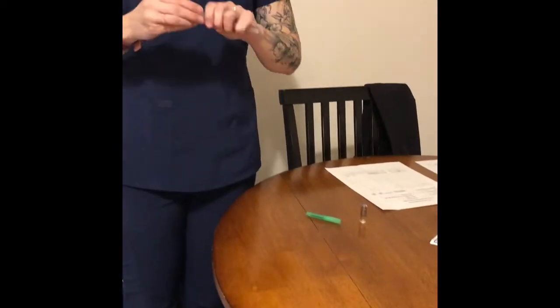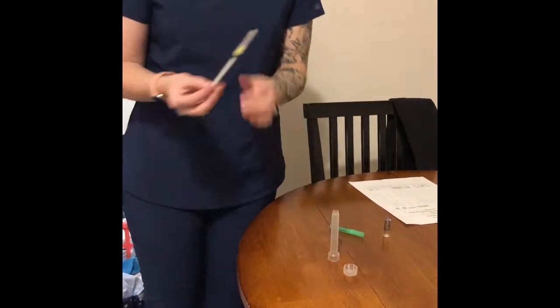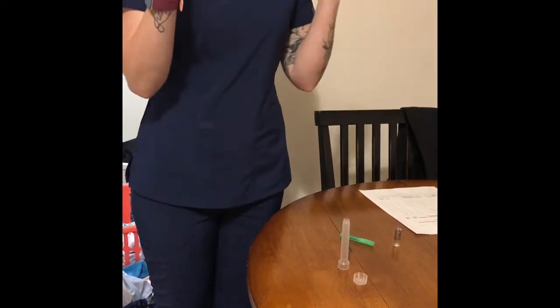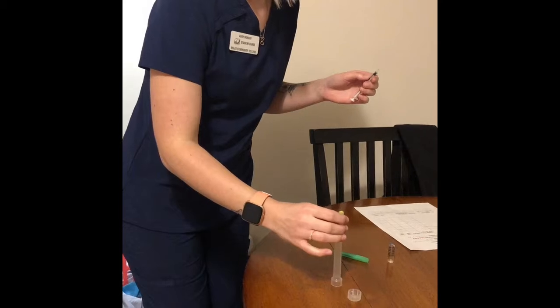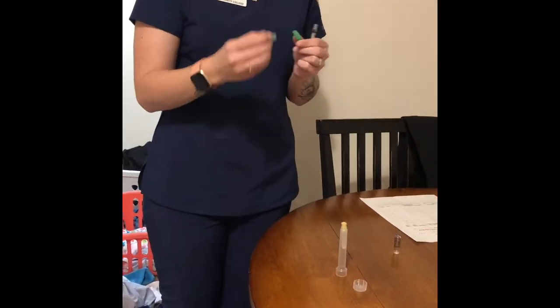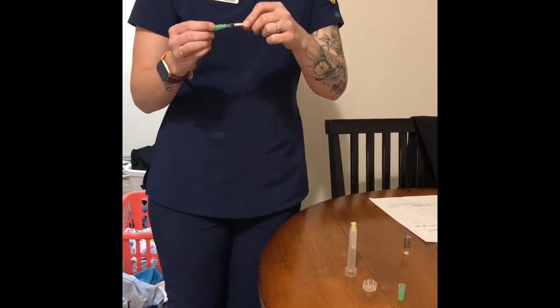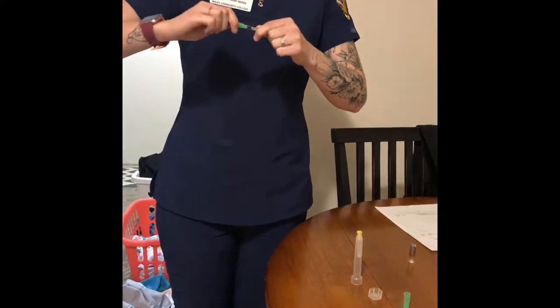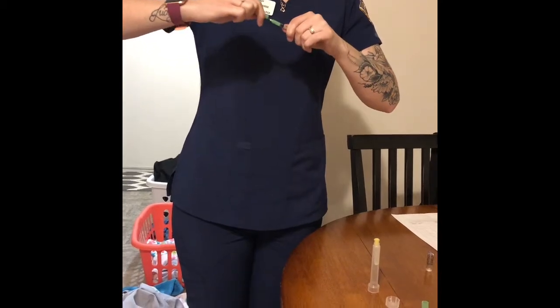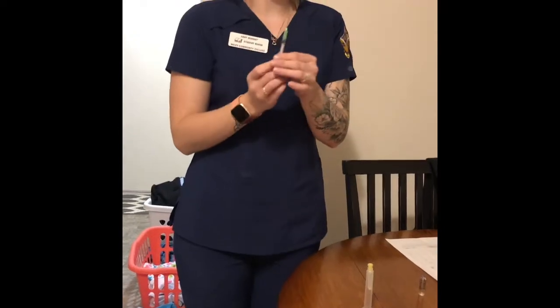So I have my needle here, and I'm actually going to trade out the needles. I want to get my filter needle. So you're okay to touch this at the hub. And careful not to touch anything. Twist a little bit. So you have your filter needle.